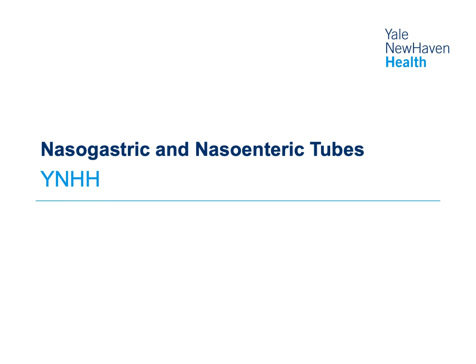My name is Will Cushing, and I am one of the physician assistants on the hospitalist service here at Yale New Haven. More importantly, today I'm one of the members of the procedural team here at the hospital. And our goal for today is to provide some background information about nasogastric and nasoenteric tubes. We will then move on to discuss some of the techniques and resources we have at our disposal for placing these tubes. And then we'll end today with a case that highlights some of the issues that can come up if these tubes are not placed correctly.